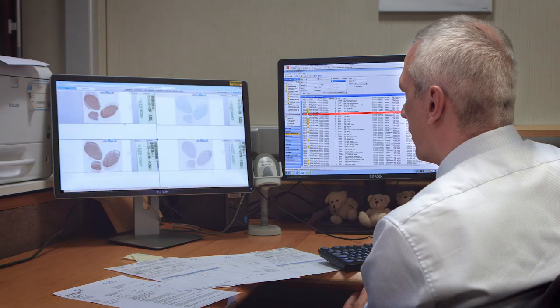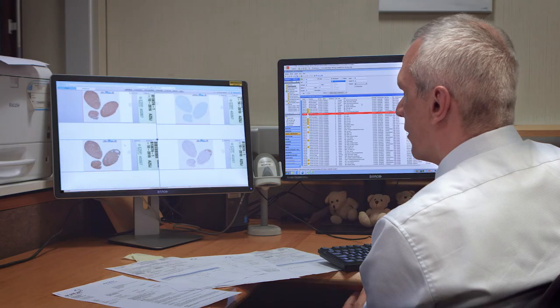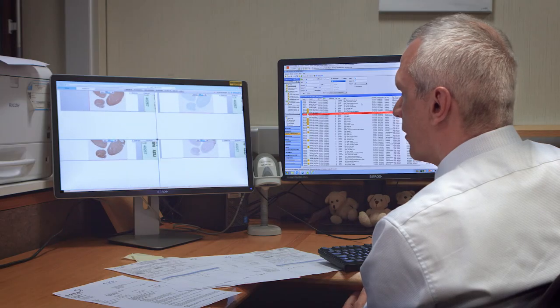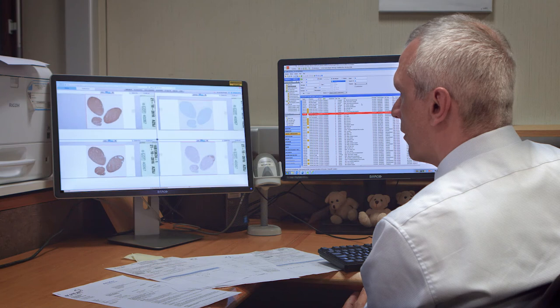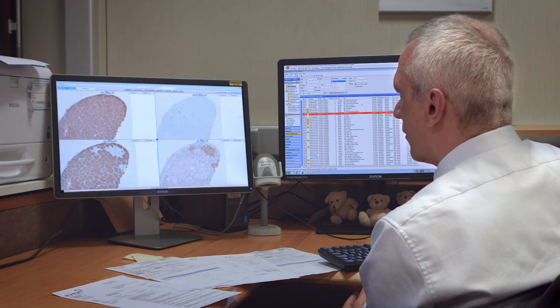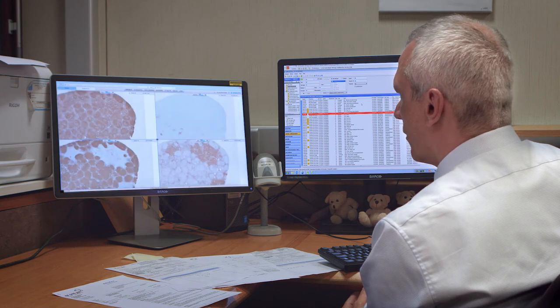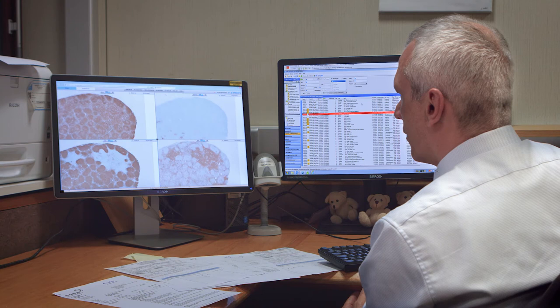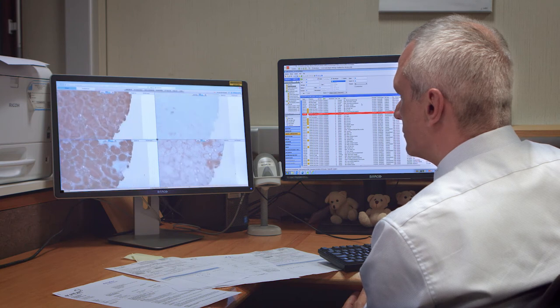In lymphoma pathology, you always have a lot of immunohistochemistry stains. With digital pathology, you can open up to 10 slides in one screen and align them.